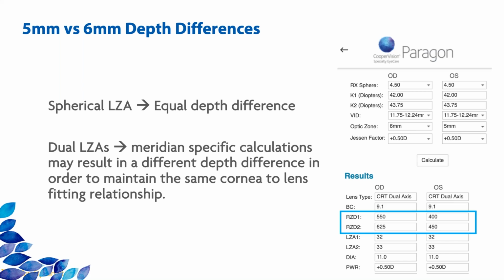But for me, even knowing the difference in the design, I sometimes cannot tell the difference in the fluorescing patterns. Especially for CRT lenses, we all know that it tends to blend in terms of the clearance under the return zone.